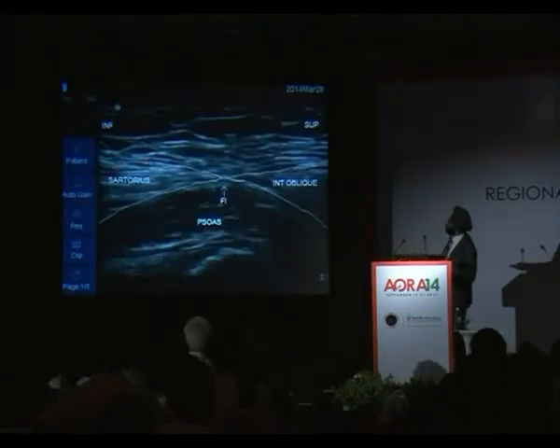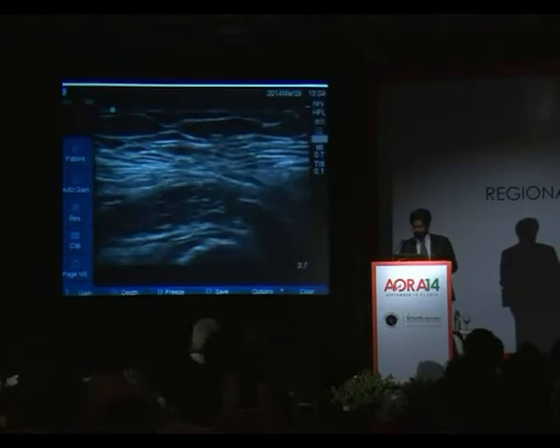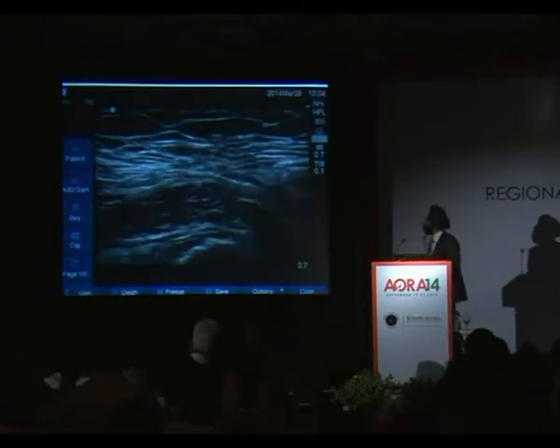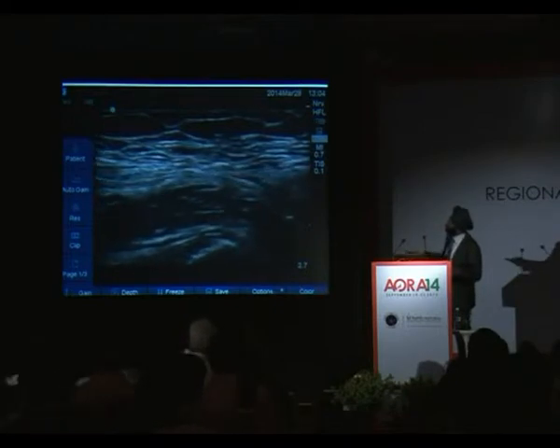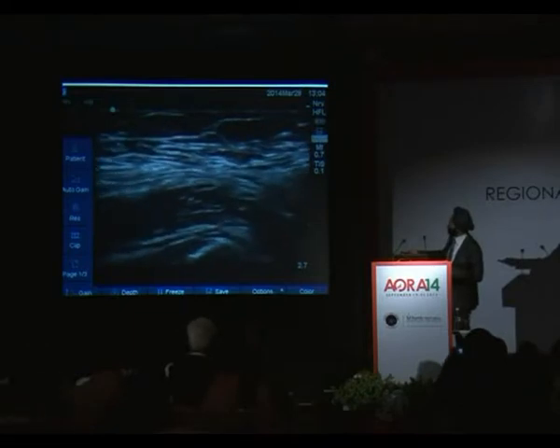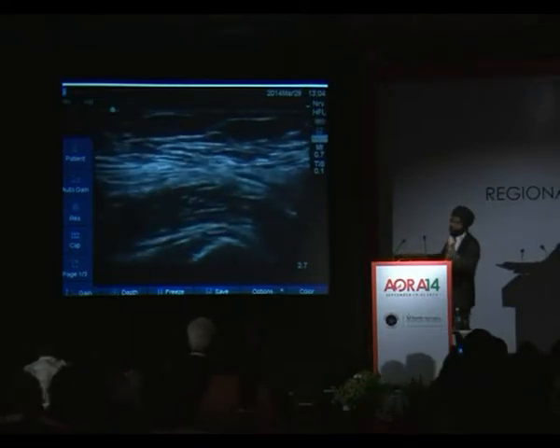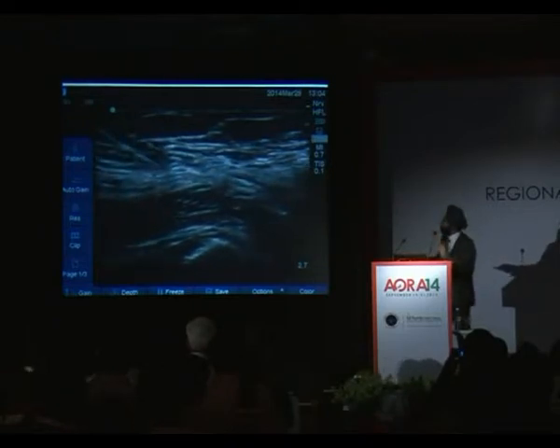So this is our sartorius. This is internal oblique. We see our ilium here, and we see our iliacus, and the needle is going to come from this side. So again, the two same things. Get your needle through the sartorius. You'll feel a pop here. You'd normally need to retract it a bit to get into that exact plane to peel the fascia off.